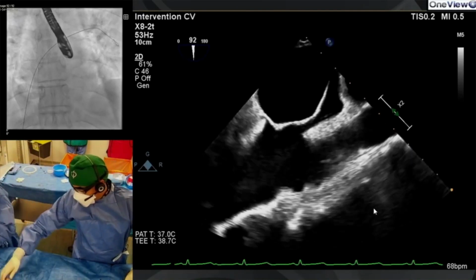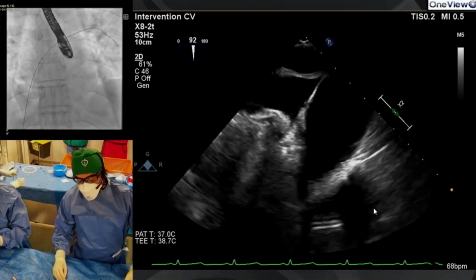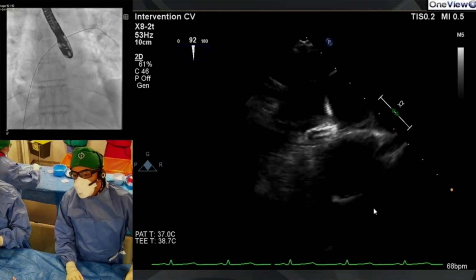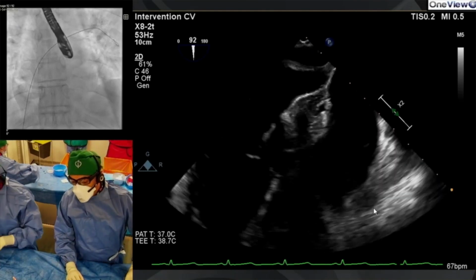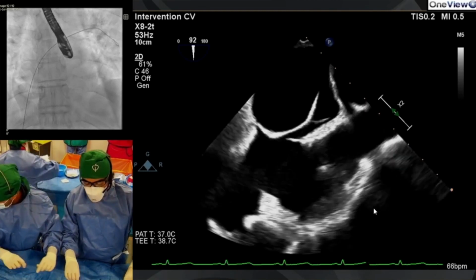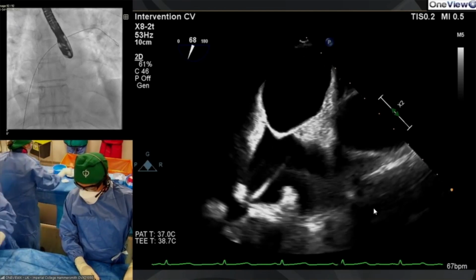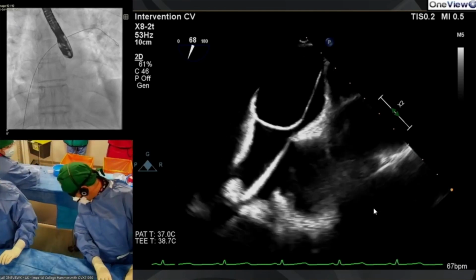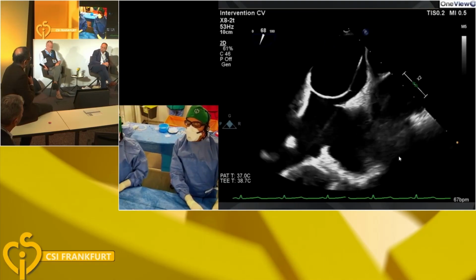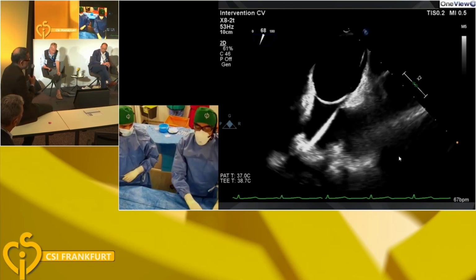It's very nice and deliverable, and actually patients do, well, just anecdotally, people that come back relatively soon after their closure do seem to have negative bubble echoes. They seem to close pretty early on. I mean, I don't know what Iqbal's thoughts are from his own patient cohort. I've got to say that our closure rate for most of our PFOs is pretty high, and we do always check with the bubble echo. I'm certainly not minded to say it's cured because we put a device in.